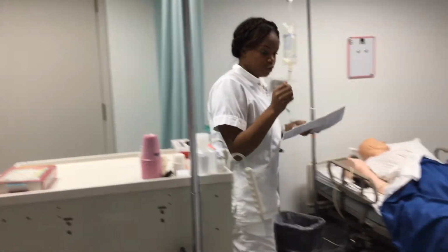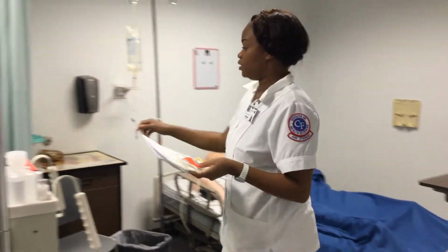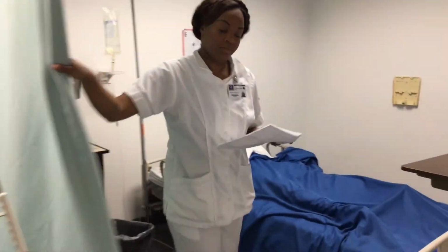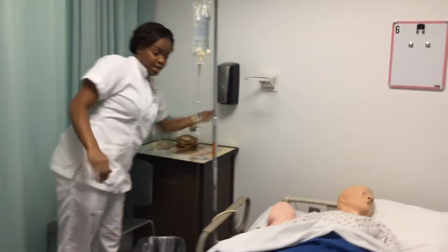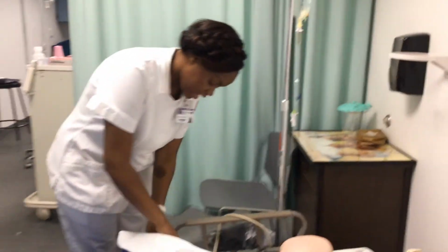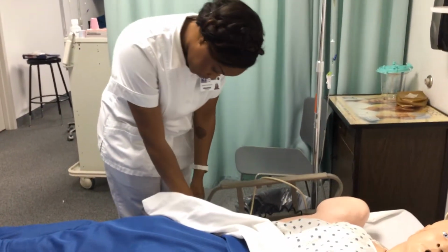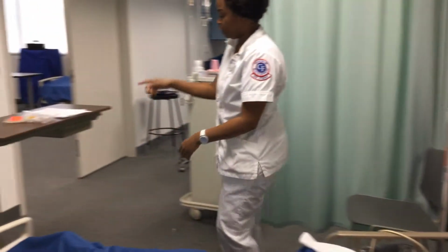As I'm going into the patient's room, I'll knock on the door. Knock, knock. Come in. I'll close the curtain behind me for privacy. The thing on the bed table. Good morning, Mrs. Jones. How are you? Performing hand hygiene. Good. My name is Latasha. I'm a student nurse for the College of Central Florida. Can you please tell me your name and date of birth? Gloria Jones, 7588. Thank you. I'll compare that to my MAR.